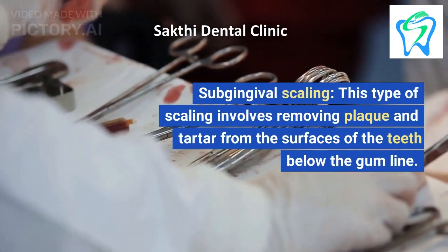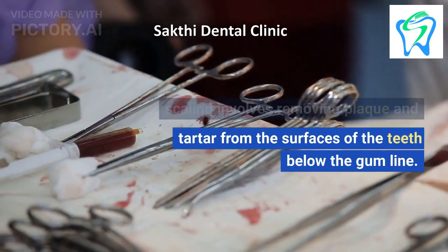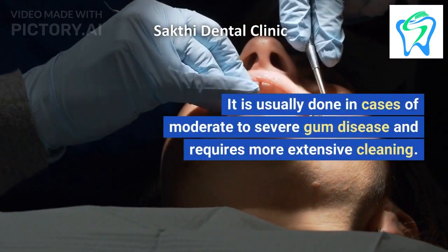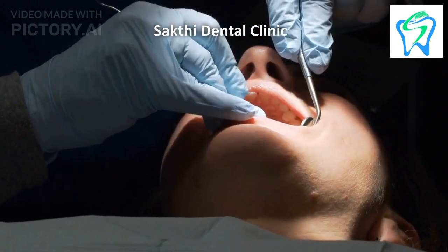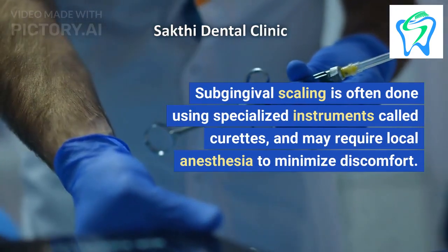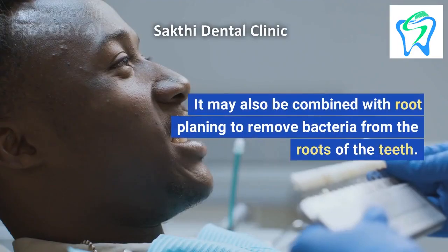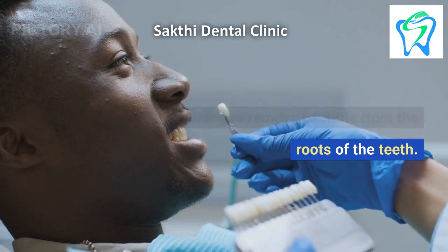2. Subgingival scaling. This type of scaling involves removing plaque and tartar from the surfaces of the teeth below the gum line. It is usually done in cases of moderate to severe gum disease and requires more extensive cleaning. Subgingival scaling is often done using specialized instruments called curettes, and may require local anesthesia to minimize discomfort. It may also be combined with root planing to remove bacteria from the roots of the teeth.